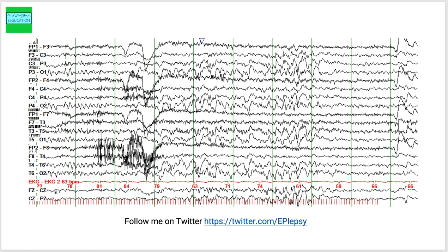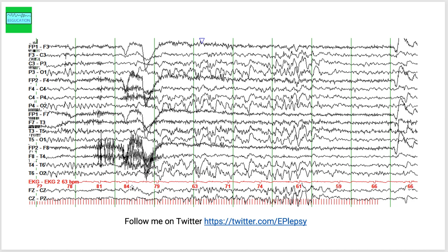This is another example. This is a muscle artifact here. This hole, for four seconds, you see a photoparoxysmal response. Photoparoxysmal response comes in different shapes and sizes. You don't always see a very clear spike and wave discharge. Sometimes what you see is fast frequencies overriding a slow background.